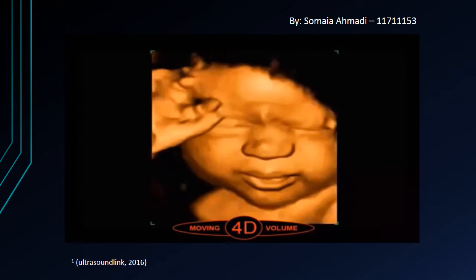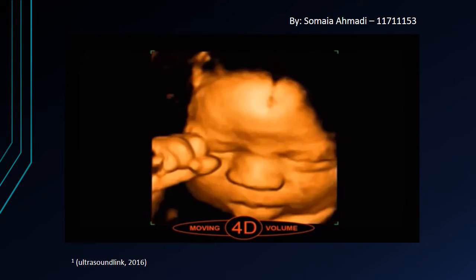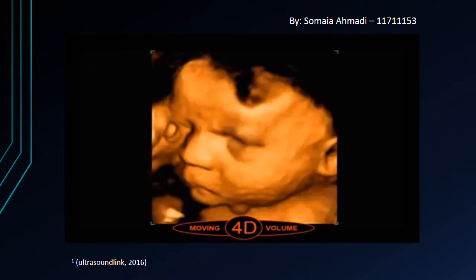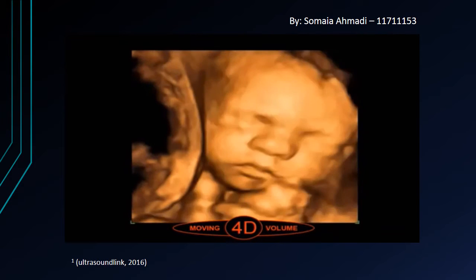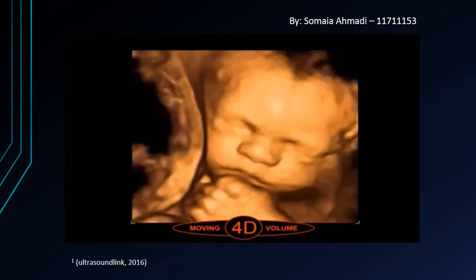But first, a quick look at one of the aspects of 4D ultrasound. In this example, a sample video of a fetus in the womb. Here you can see a 3D live video of the fetus, something which is not seen with a traditional 2D ultrasound.